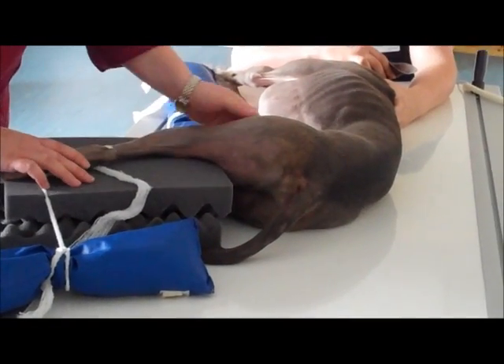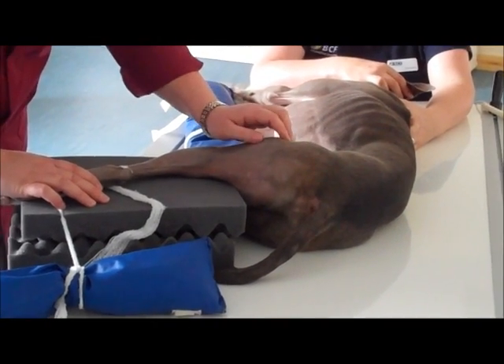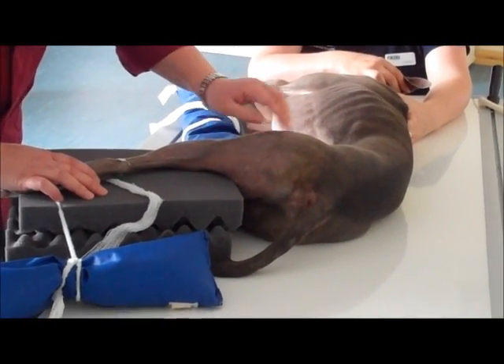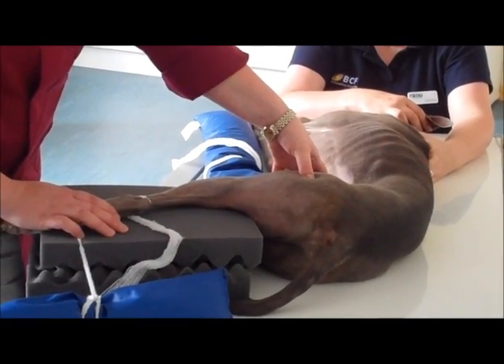We can now collimate and place the centre of our beam exactly where we want it to be — that's usually at the level of the coxofemoral joint, which you can palpate on the lateral aspect here.